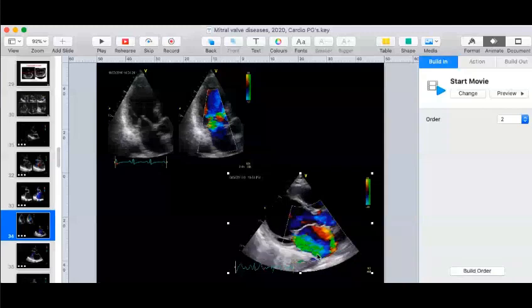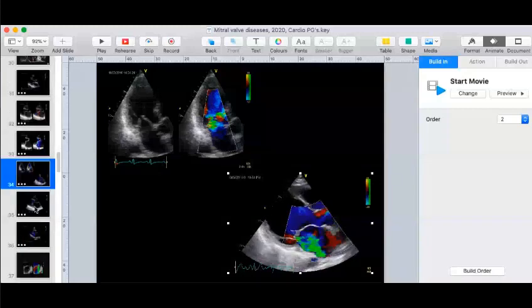So just to summarize, usually an anteriorly directed jet is because of posterior mitral leaflet prolapse, while a posteriorly directed jet is due to an anterior mitral leaflet prolapse. So that is the usual thumb rule. But when you have an ischemic MR, the posterior directed jet is not because of any leaflet issues or any prolapse. It is primarily because of a tethered posterior mitral leaflet. Is that okay? Yes, sir.